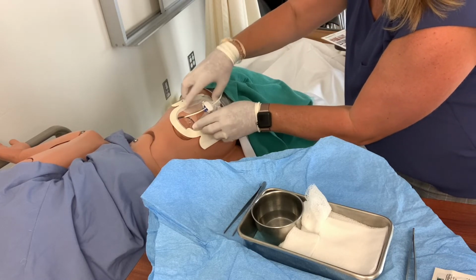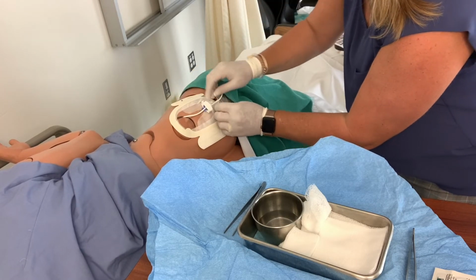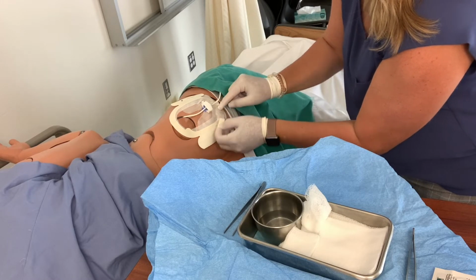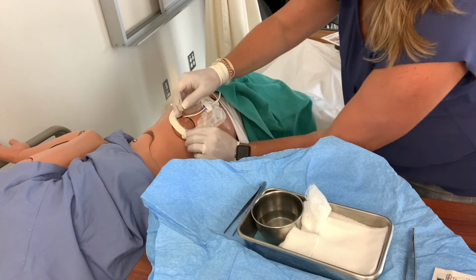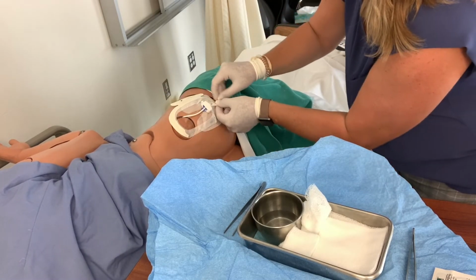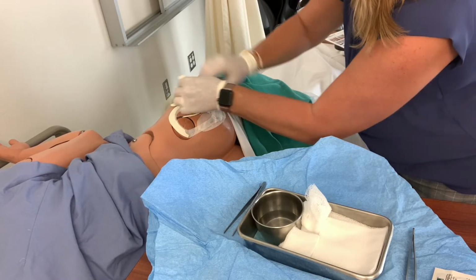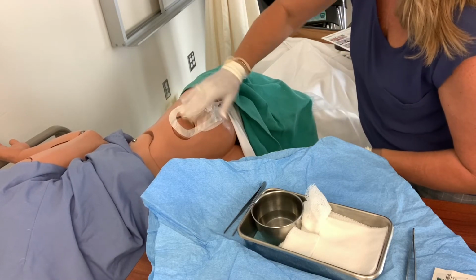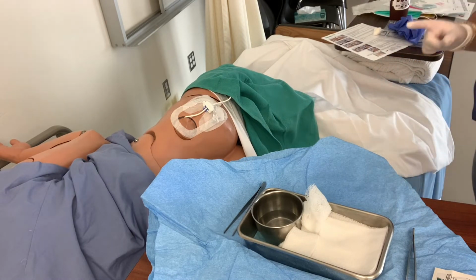And then I'm just going to work my way around and try to get the air out and remove the strip that's on the outside. Okay, so again, I'll take that side. Sometimes these are hard to get a hold of when you have gloves on. Okay, so that is a percutaneous catheter dressing change.